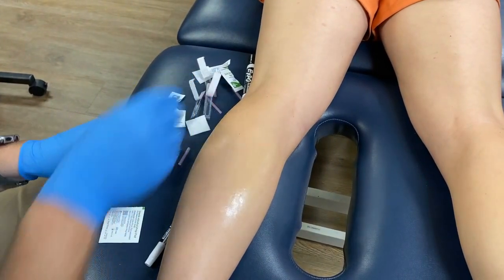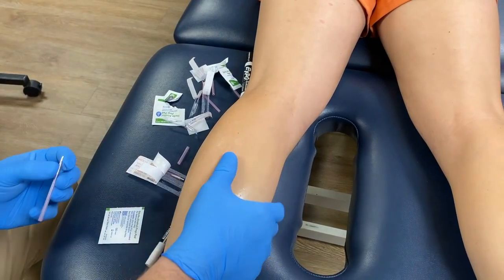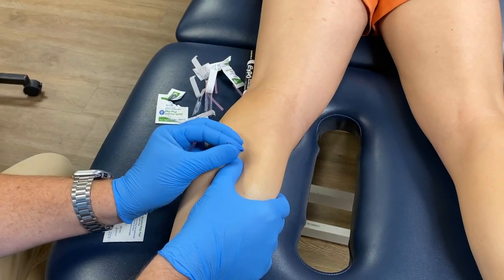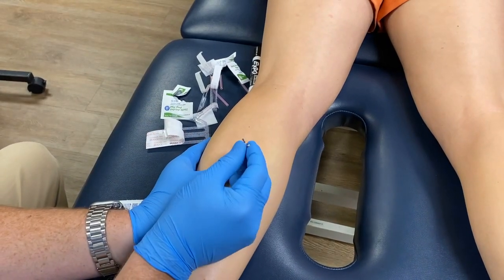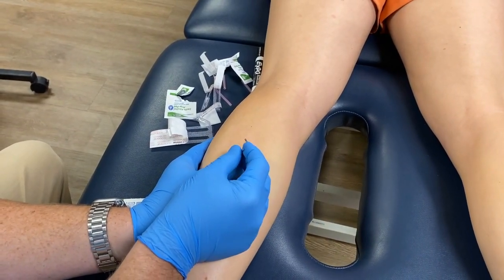For the gastrocnemius, we're still going to clean the area. Remember, we have the tibial nerve, artery, and vein in the midline, so I'm going to place my thumb in the middle to grasp the tissue of the medial gastroc head and tap my needle in away from the midline, using anywhere from a 40 to a 60-millimeter needle. For the lateral head of the gastroc, I'm again going to place my thumb in the midline to tap the needle in and send it away from the midline into the tissue between my fingers.